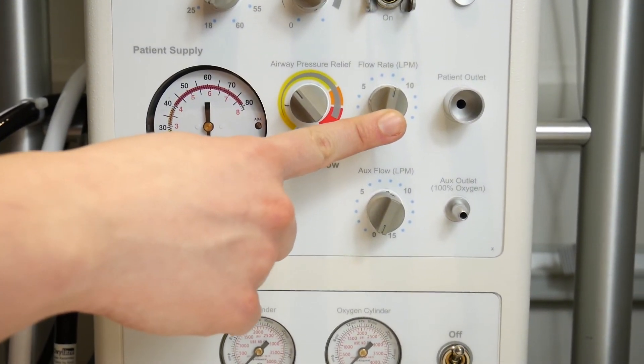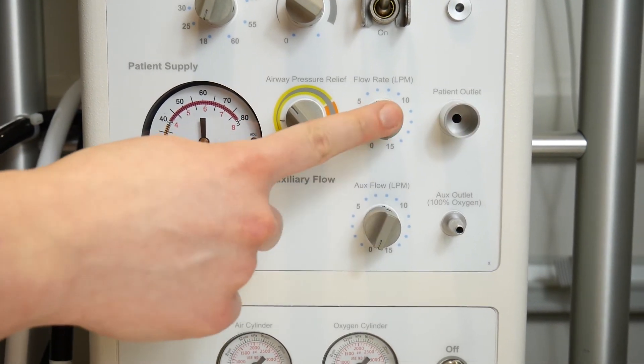This dial controls the flow rate through the gas outlet. Most people set it at 8 liters a minute.